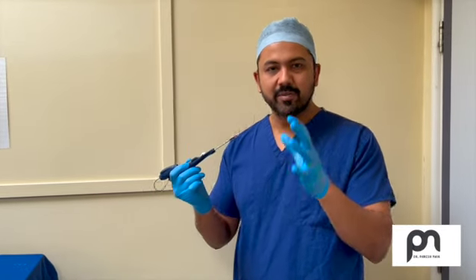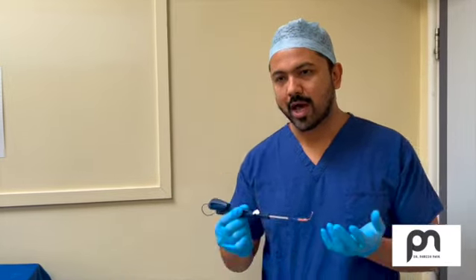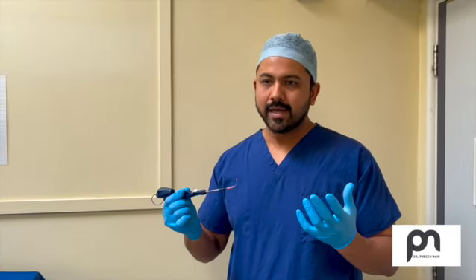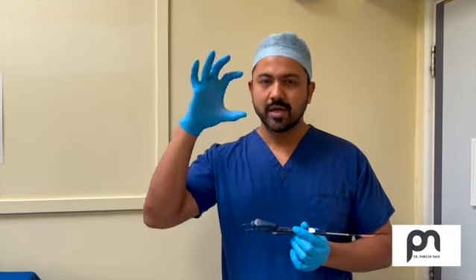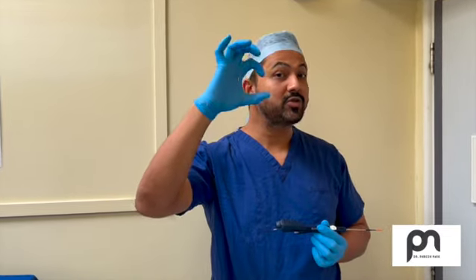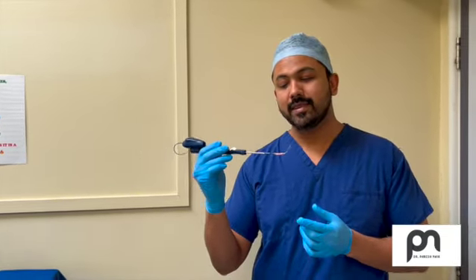So what are the indications? Many times the sinuses have minimal disease. You don't want to do a large antrostomy or large opening because there's always a risk of stenosis. Whatever surgery we do, if the opening increases, it is going to close by 50%, especially more when you have bone over there. So that's the case.